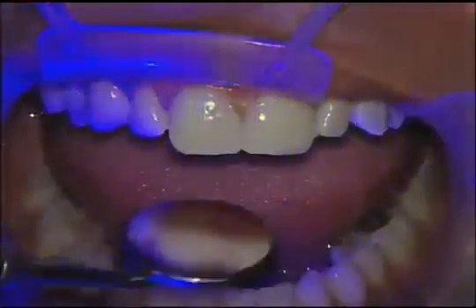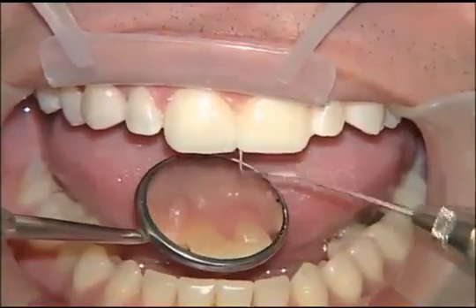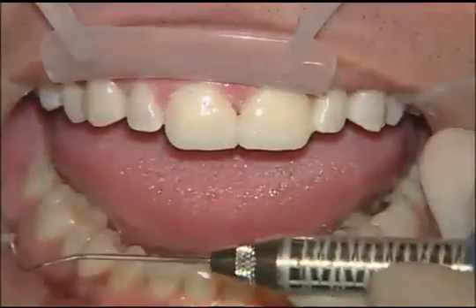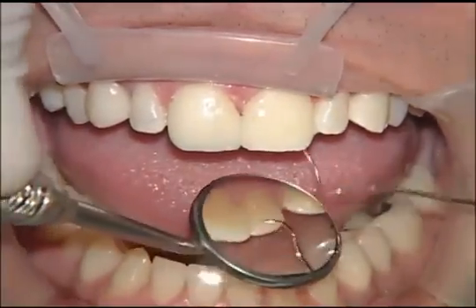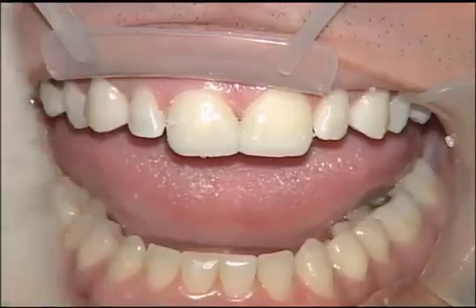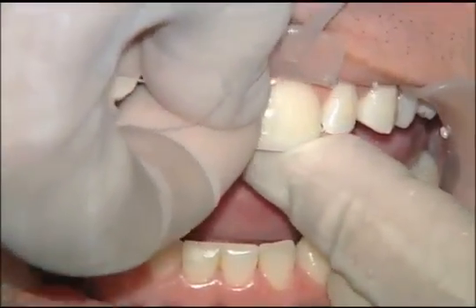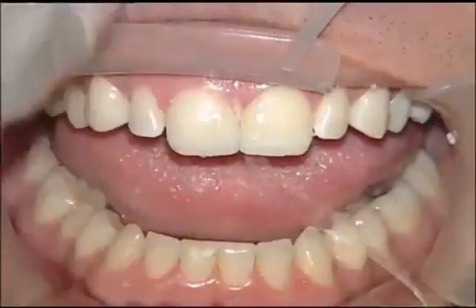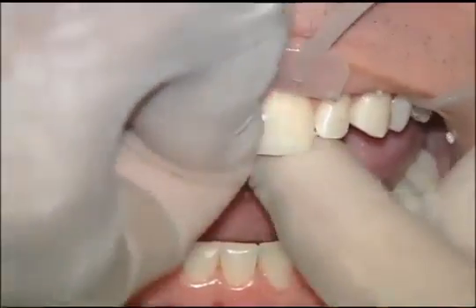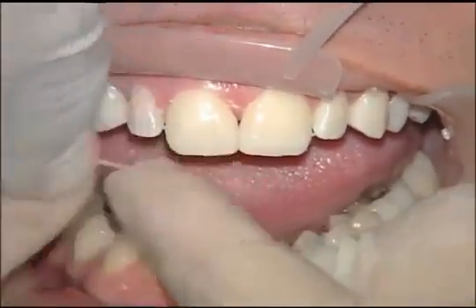We're going to cure the lingual for, again, 1.5 to 2 seconds, and I'll remove any excess that we have back there as well. And once we begin to remove this excess, we've done most of the cleaning, and really all that's left is for us to go ahead and clean interproximally with some dental floss. We're going to make our first attempt to go through between the central incisors with dental floss, and we were successful. That's the reason when we do the tack and wave why we try to keep the light away from these interproximal surfaces. We'd rather just cure right at the gingival and set the cement there and not necessarily cure it interproximally where it's going to be difficult to remove later.